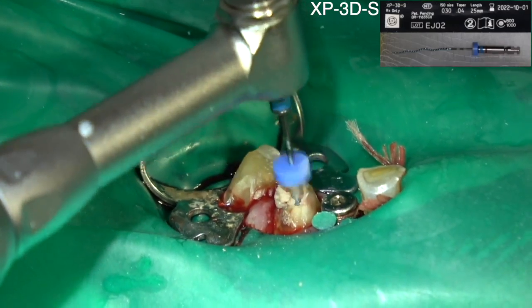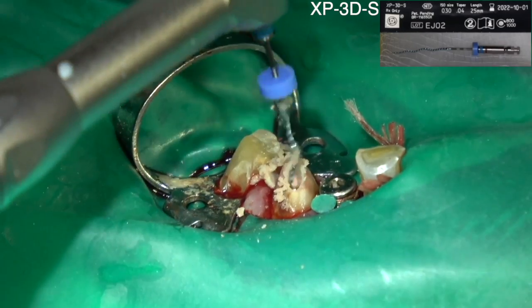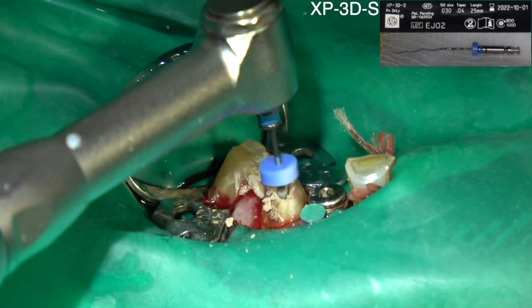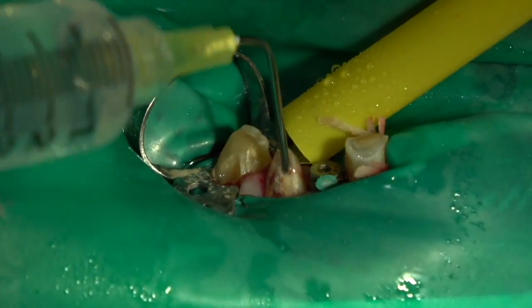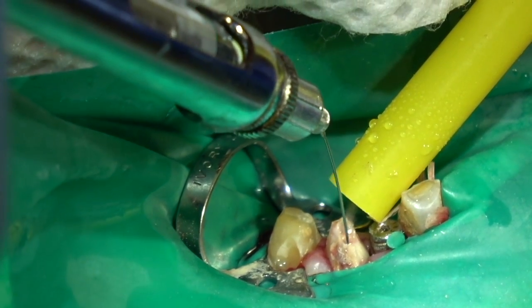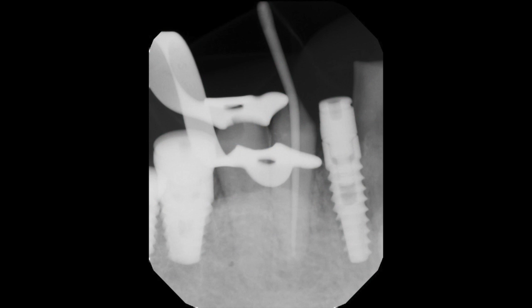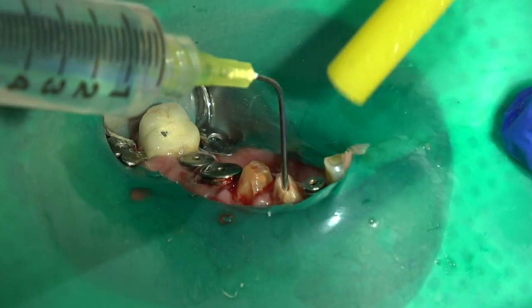You're not squirting this into the canals hard — no pressure. You're just squirting it into the coronal part. The rotary files take it down into the canals, which is why you want to do crown-down: open the coronal part of the canal first so it holds the irrigating solution. It just pools in there, and when the files go in, it takes the dilute sodium hypochlorite with it. You can see it's just a little bit shy of the apex, which is perfect.